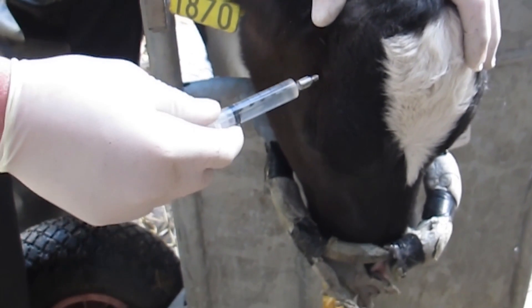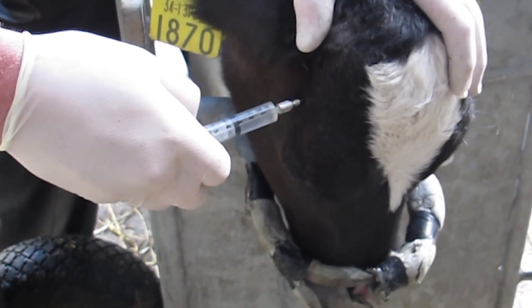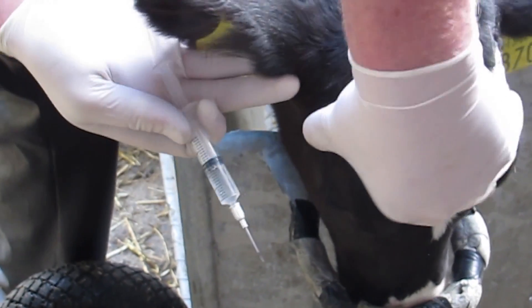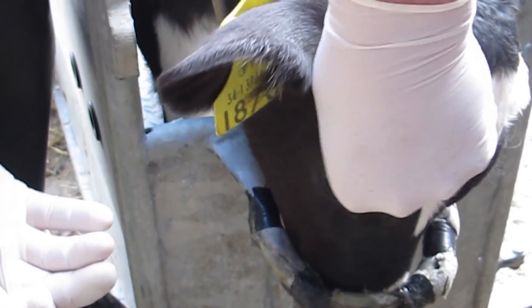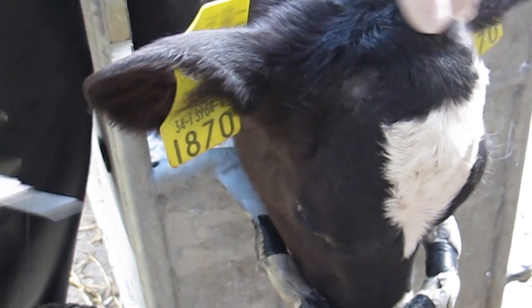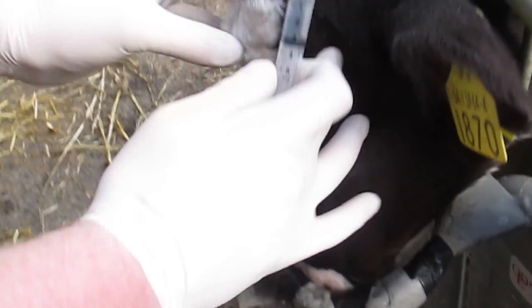If injecting an anesthetic to an older calf, inject 2cc into the cornual nerve on each side of the calf's head. The cornual nerve runs from directly behind the eye to the base of the horn. Insert the needle perpendicular to the skull into the palpable soft tissue one to two inches behind the eye.